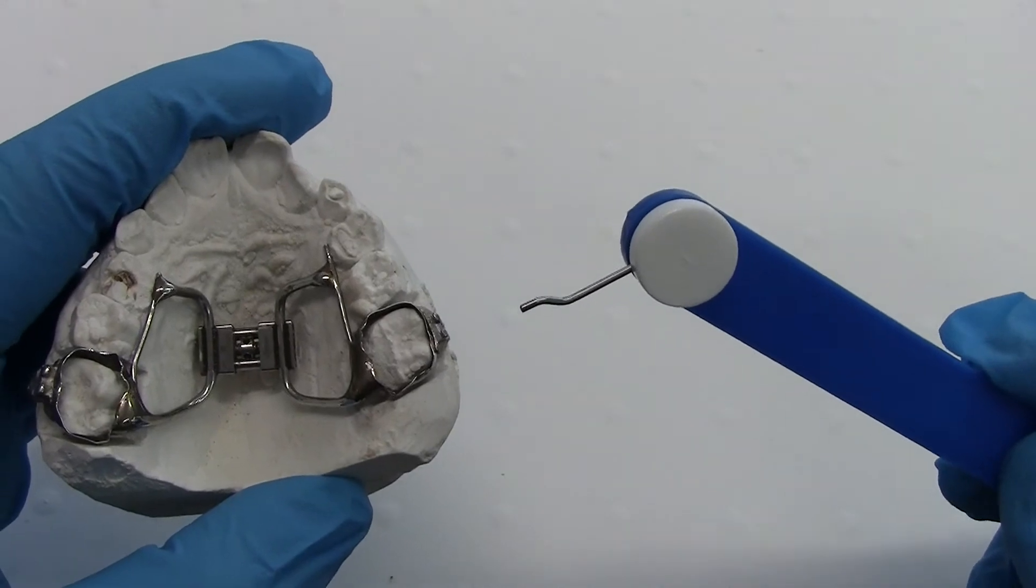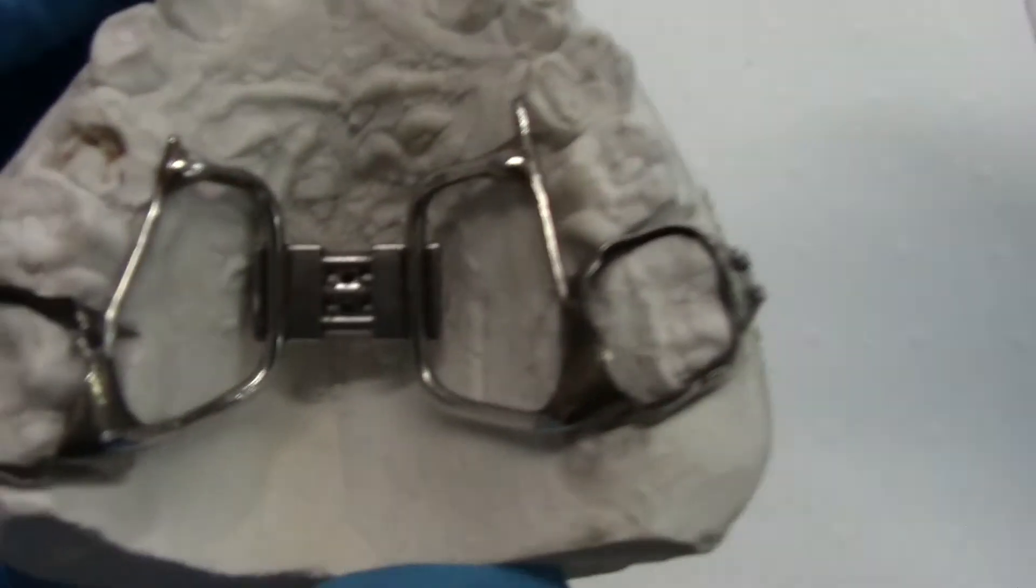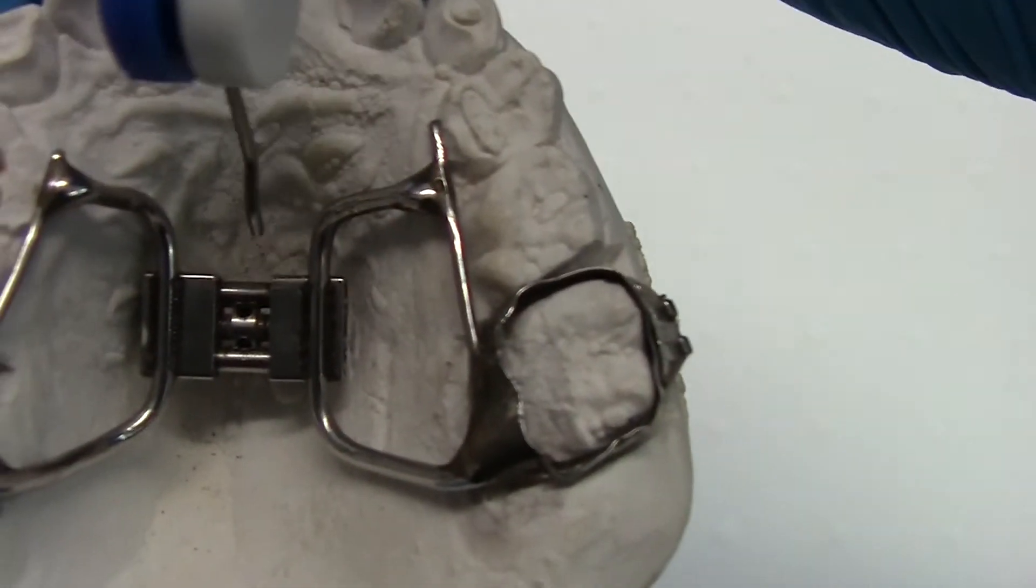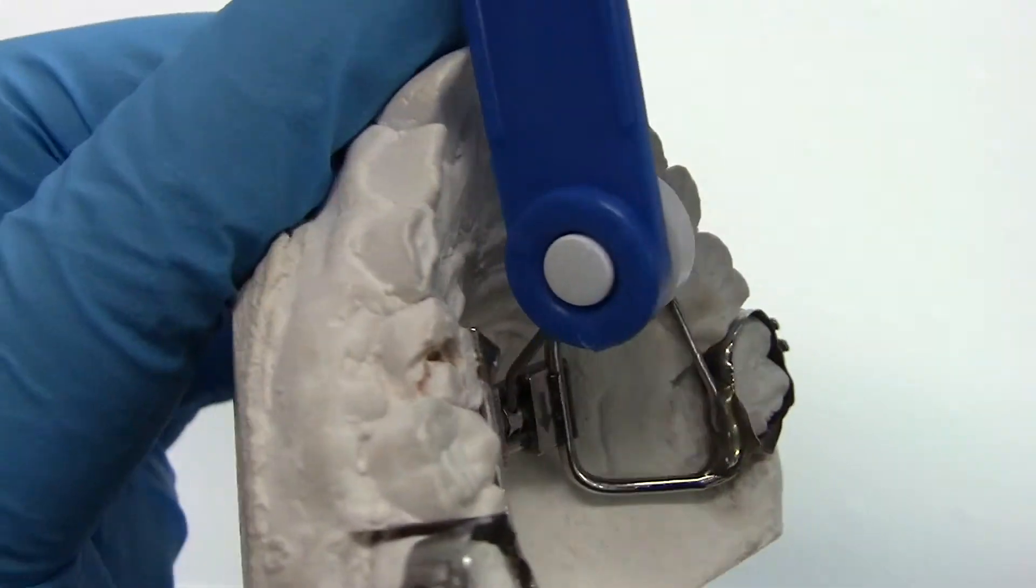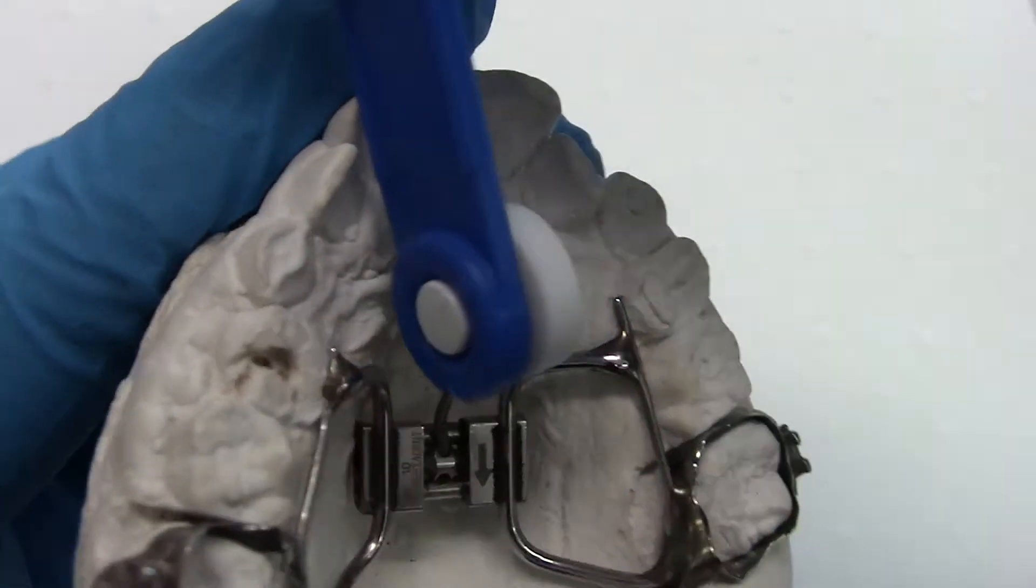Place the key in the front hole of the RME. Ensure that the handle is touching the upper front teeth.